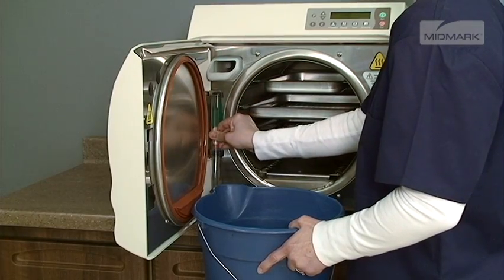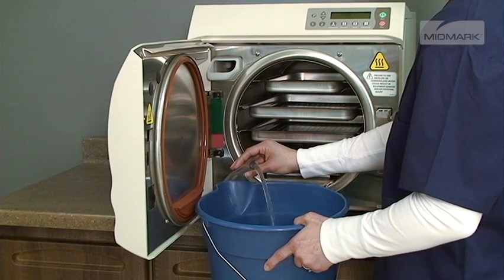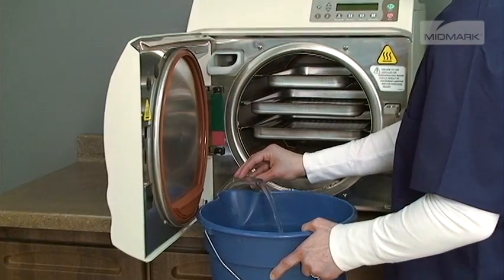After disconnecting the upper portion of the water level indicator, bend it downward and let the reservoir drain into a suitable container — a bucket, for example.